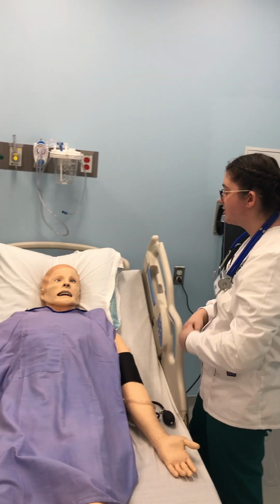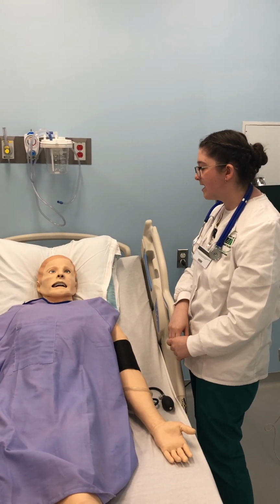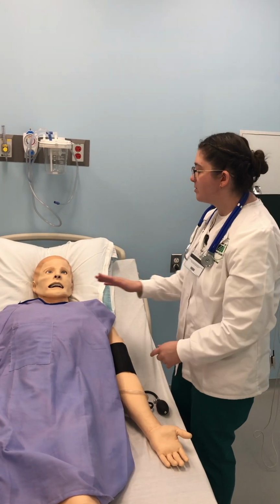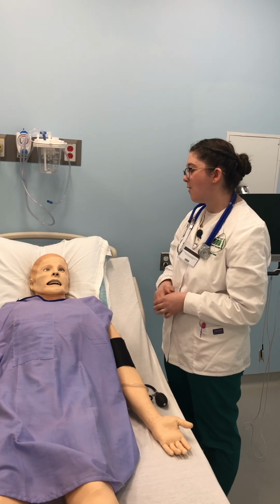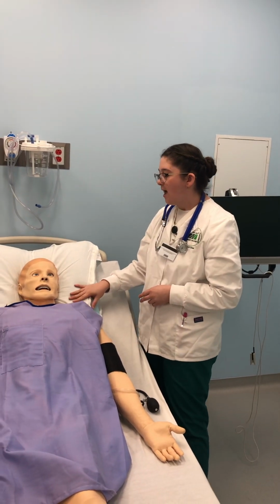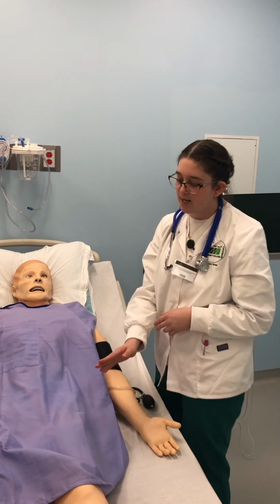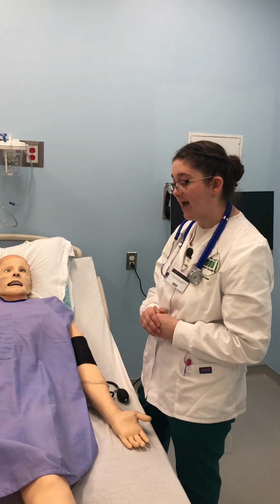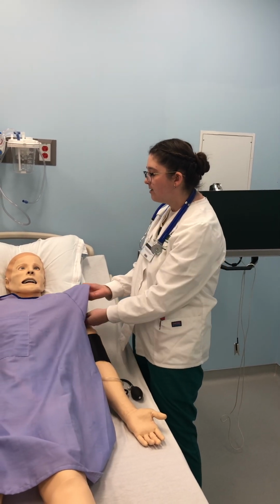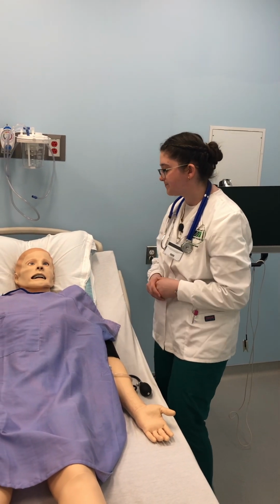Next, I'll be taking temperature. And I've taken an oral temperature, and it was at 97.6 degrees Fahrenheit, which is good. I would not do an oral temperature if they have anything hot or cold to drink, or if they were unable to fully close their mouth. I would do a tympanic temperature, unless they have any earaches or any drainage, then I would not use it. I would do a rectal temperature if a doctor had ordered it for a very accurate temperature. And I would do an axillary temperature if oral was not available, but I would not do an axillary temperature if they were unable to fully close their armpit.